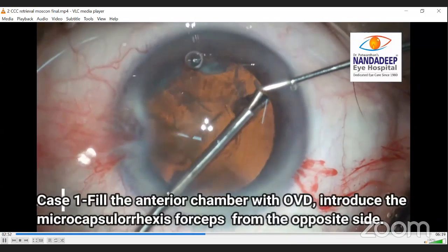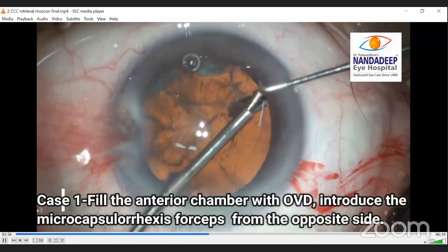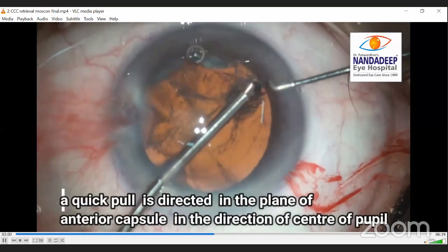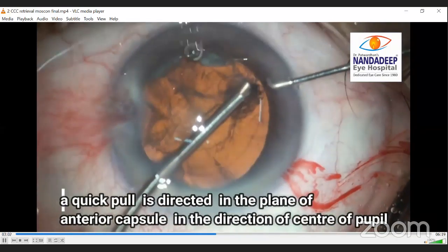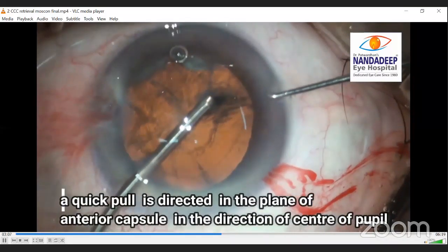So once OVD is filled again, it is better to use Viscoat. You have to hold the capsulorhexis flap which is extending into zonules. Once you hold it firmly, just pull it quickly towards the center.